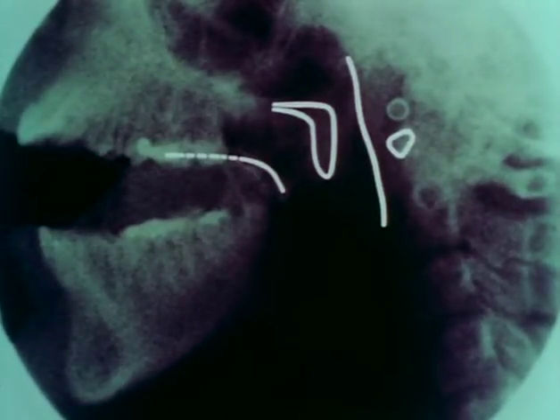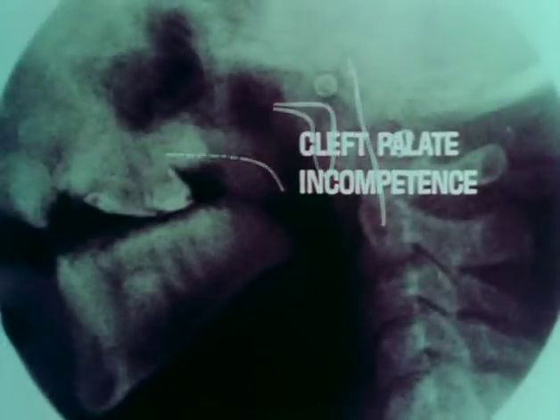Note the large velum, the position of the tongue, and superior constrictor. A posterior nasal spine was present. Only occasionally the velum contacts the superior constrictor on isolated vowels. The high concavity of the sphenoid vault is the result of the adenoidectomy. This 12-year-old cleft palate patient had a T&A performed at age 9. Continuous nasal speech was noted.